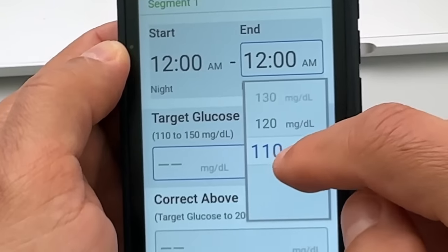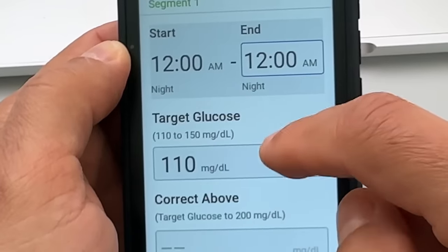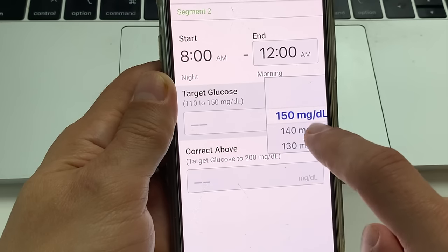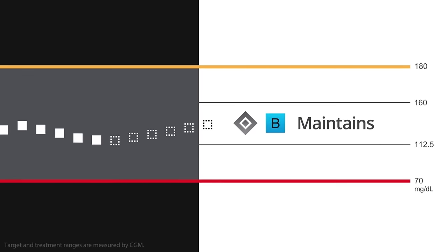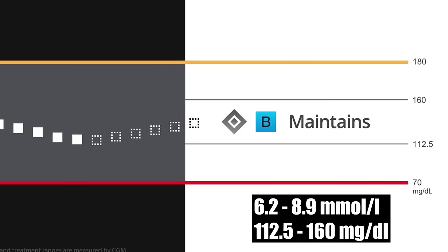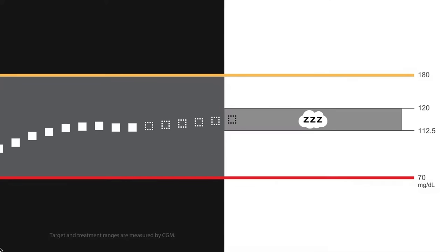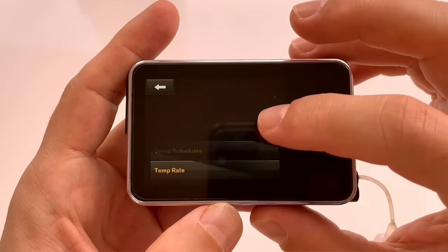Another difference is that Omnipod 5 lets you set your glucose target range anywhere between 110 and 150 mg/dL, and you can have eight different profiles throughout the day with different targets — for example a lower target at night and a higher target in the afternoon. With T-Slim X2 there is no way to set the target blood sugar. Control IQ targets a range between 112 and 160 mg/dL, and between 112 and 120 mg/dL while in sleep mode. You can switch to sleep mode manually or have the pump turn it on and off at a defined time of day.